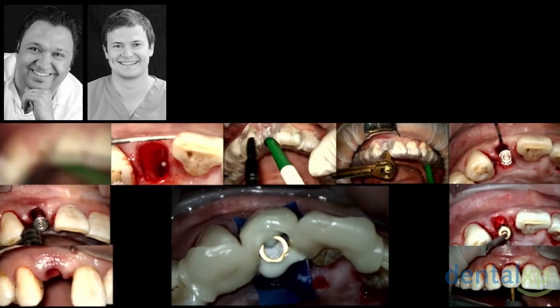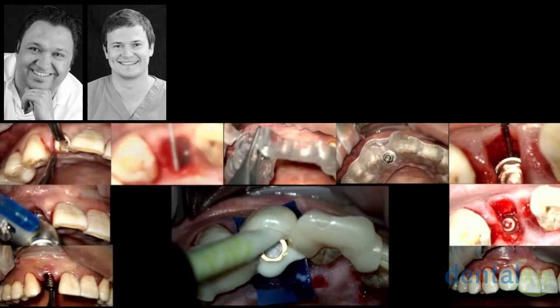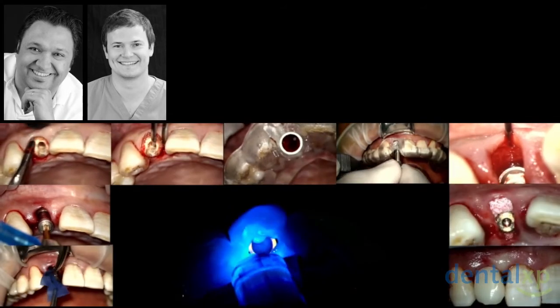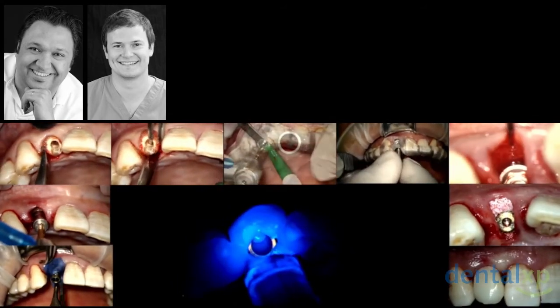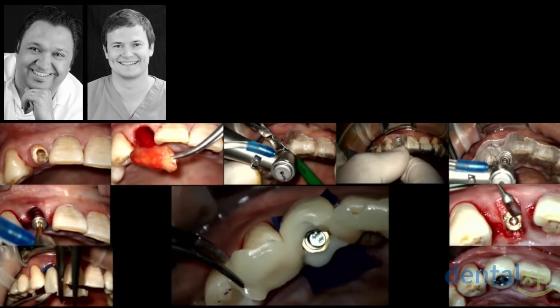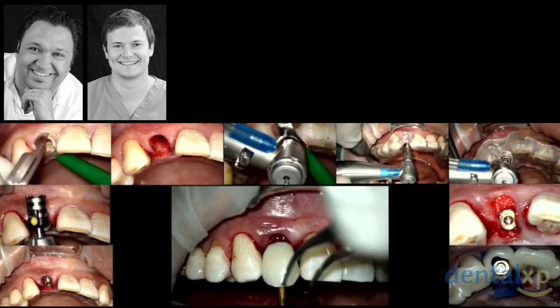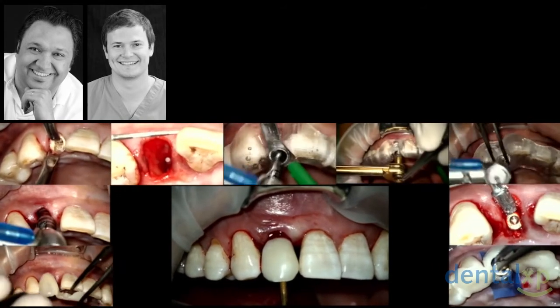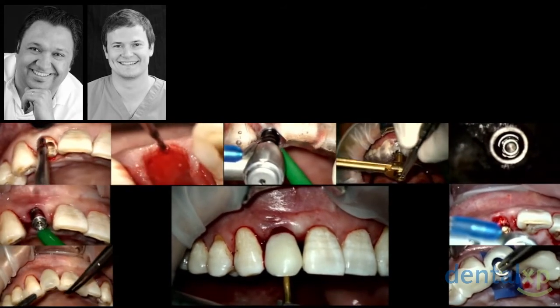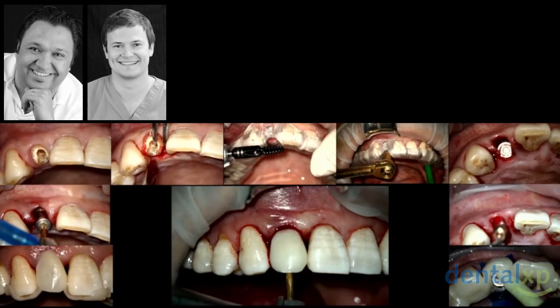Then we use a piece of rubber dam, you see that, to isolate the surgical site, and we use multi-link to link the abutment to the temp shell. Your goal here is only to capture the abutment position with the temp shell. All the other modifications for the emergence profile will be made extraorally. So here is the result after the connection between the abutment and the temp shell. You see that we remove it. All the other modifications will be made extraorally, and here is the result once the modifications have been made.